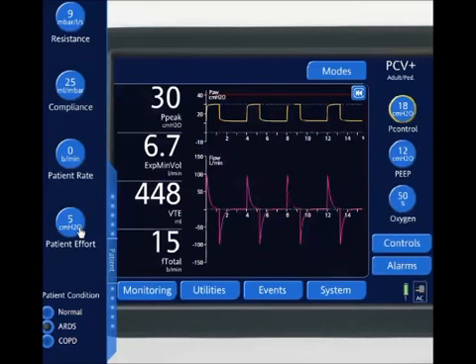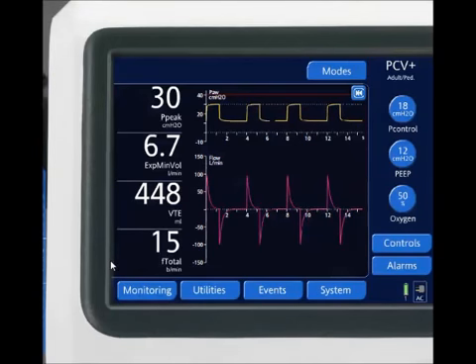And I'm going to change the inspiratory drive to make the patient very vigorous. And I'm going to turn this up to, let's just go ahead and turn it up to 30. Get right to the point. So my patient effort is very high now. I'm going to change the rate. I'm going to add the 10. Patient spontaneous rate of 10. And let's take a look at some of my measured values and everything else. So this simulator might have some lag and it might take a while.